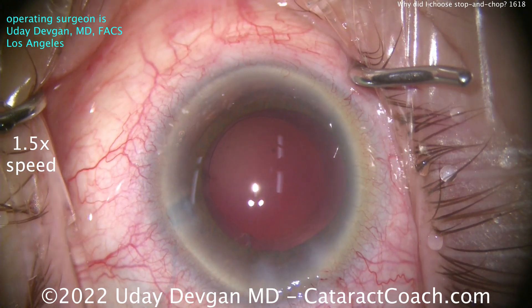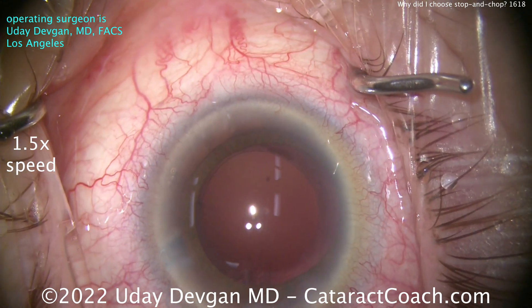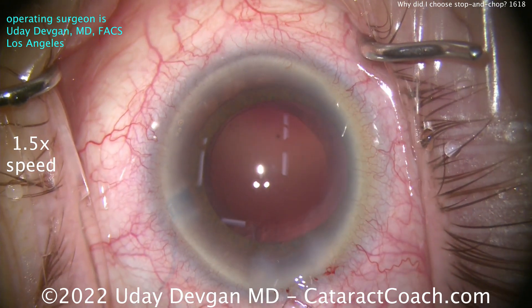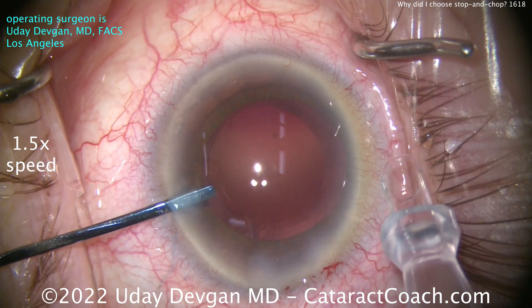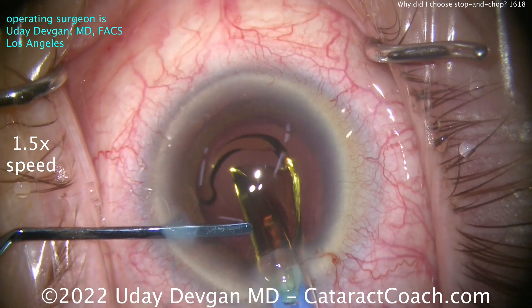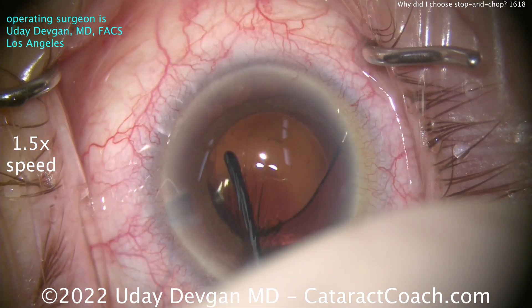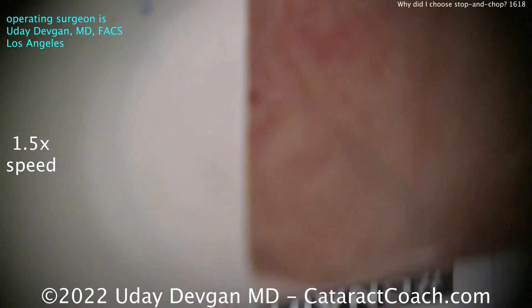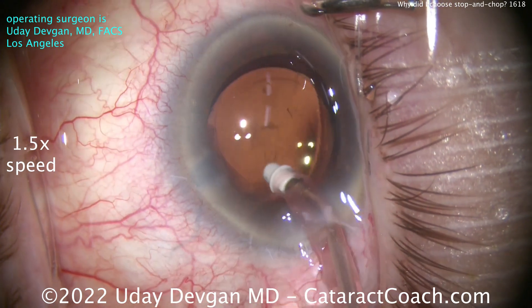Here's the viscoelastic going inside the eye. The patient's a high hyperope to begin with, so we're going to put in a monofocal lens and aim for a post-op refractive outcome of essentially plano. You can see a little bit of sub-incisional cortex — we'll get that out at the end. We're going to have to slightly enlarge the incision because this patient is getting a 28.5 diopter lens, and that requires a larger tip on the injector. Look carefully at the packaging for the IOL — the labeling clearly states you'll need to slightly increase the incision to get the IOL inside the eye. This is a monofocal aspheric lens with a power of 28.5 diopters.